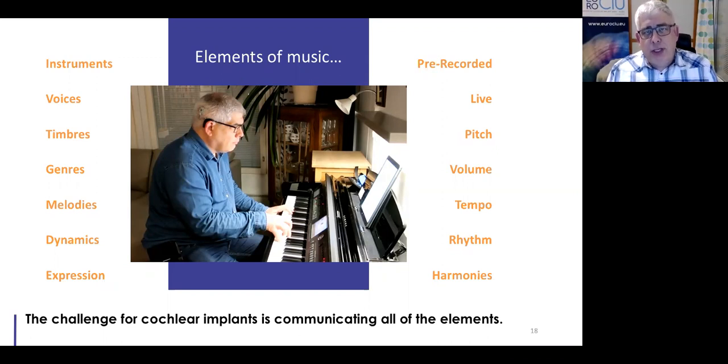In my opinion, music should be part of all implant users' rehabilitation. Listening to music, dancing, or playing an instrument will help with understanding everything that is not speech. I know that some of the brands employ in-house musicologists with cochlear implants who can offer guidance to their users. Also, recently, some brands have developed apps or PC-based programs to help with musical rehabilitation. In my experience, these tools are in their infancy, but they are a step forward.